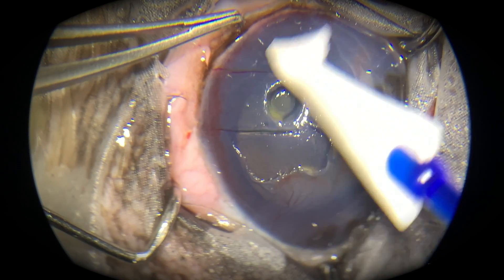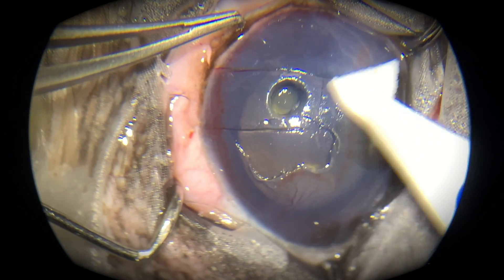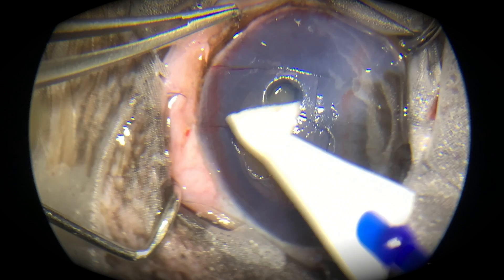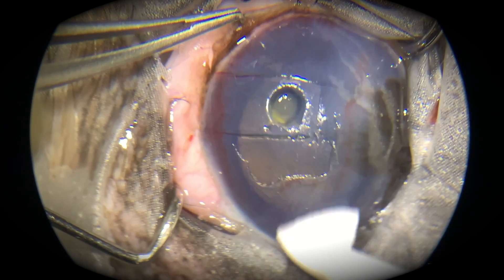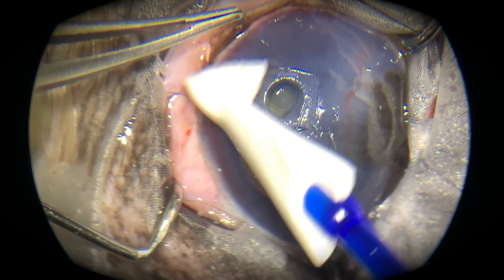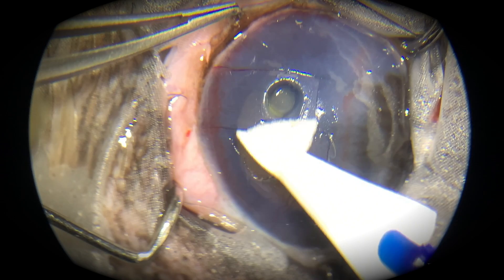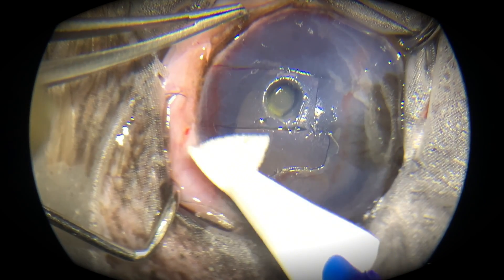This is a desmetocele — a very deep corneal ulcer that is ready to pop. The corneal incisions around the graft have already been taken. There is also a superficial non-healing corneal ulcer visible, but today we are going to perform a grafting procedure on that desmetocele.